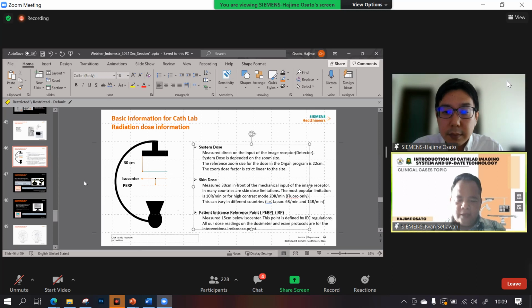The next question is: is there a maximum acceptable dose regulation for a one-time catheterization procedure, Hazime-san?